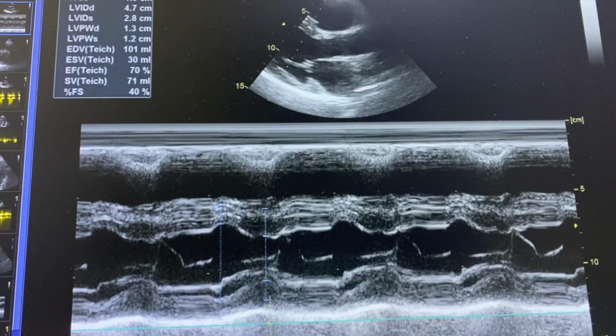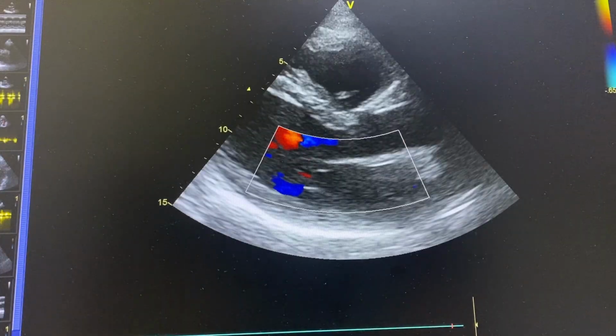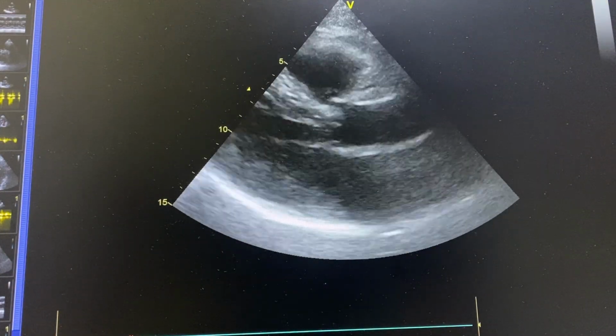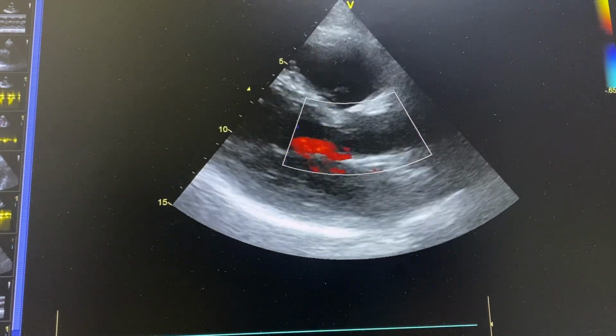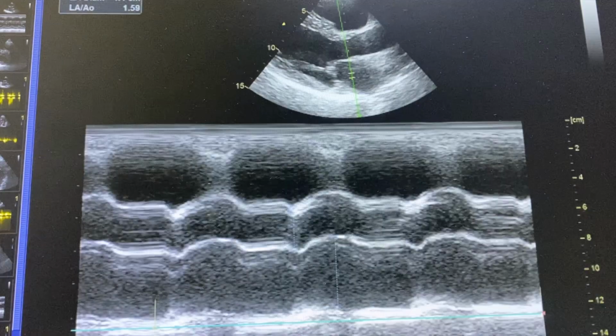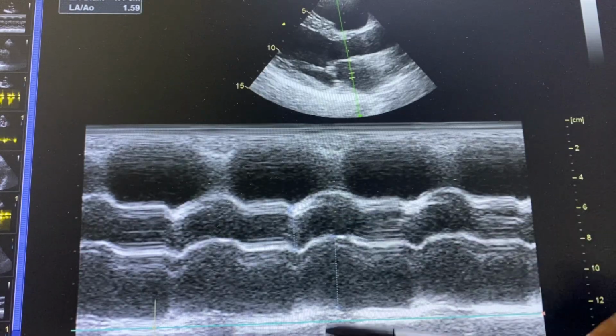Remember I was telling you the other time how to do M-mode measurements, and where we stopped was the M-mode measurements of the aorta and LA. We said we start with the PLAX view, and from PLAX we apply color. After applying color, you do the measurements. So this is where we stopped, at taking these measurements.